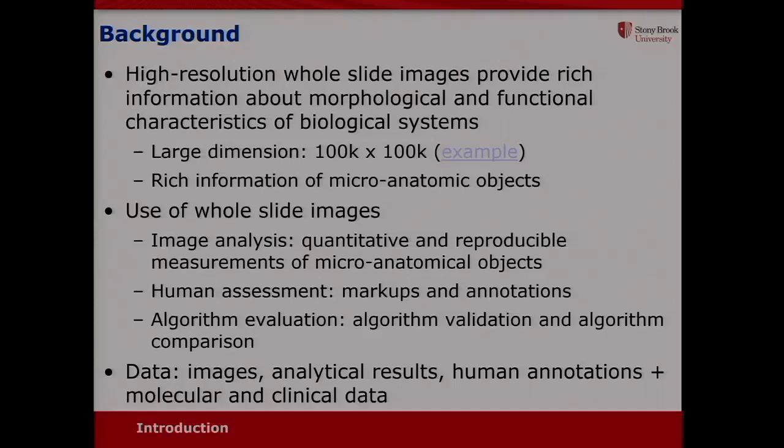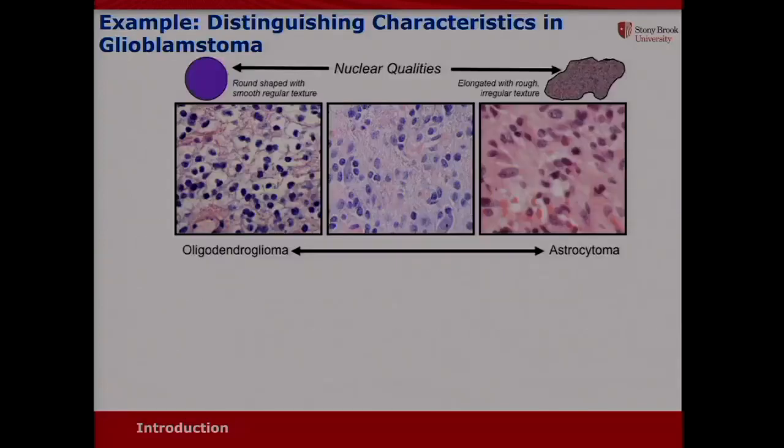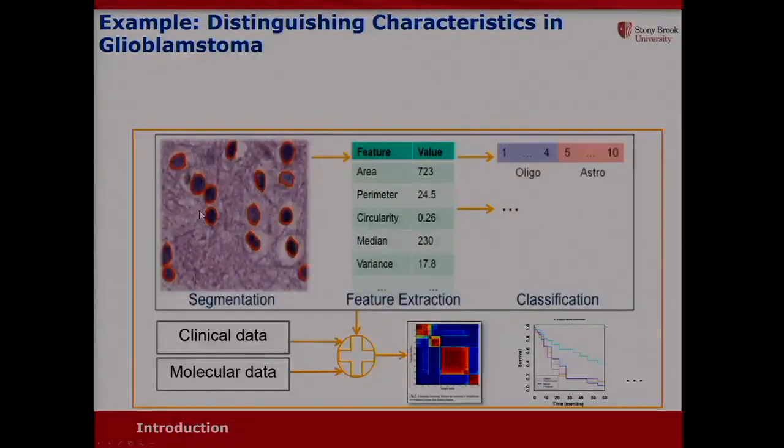That's too difficult for pathologists, and also in many cases not efficient because there's too much information from a single image. A single tissue may have millions of nuclei, cells, and a lot of other information. So instead, we can use a computer-based approach. We can extract all the information from medical images. We segment the boundaries of cells, blood vessels, and so on, and we extract features as well. Eventually we convert the image information into spatial data.